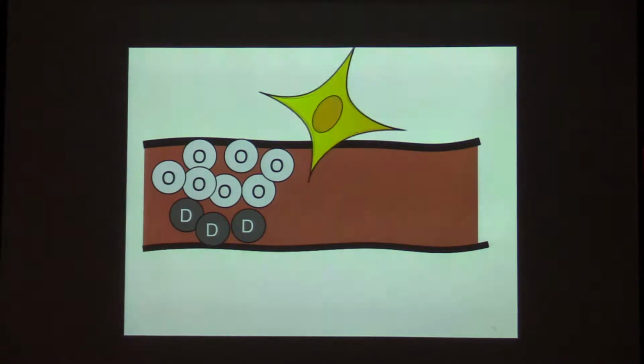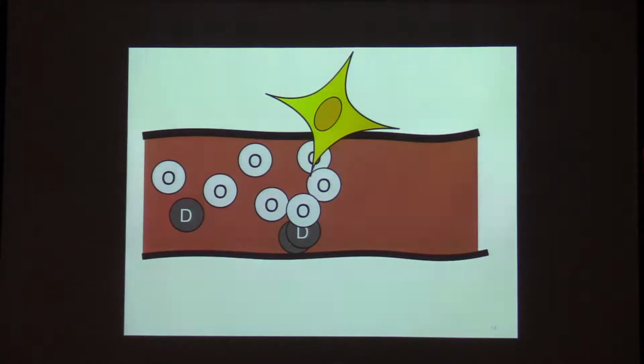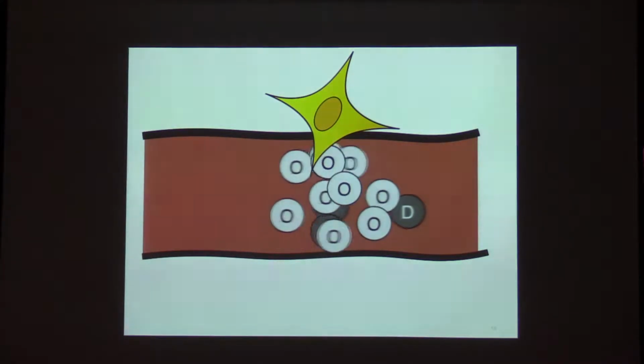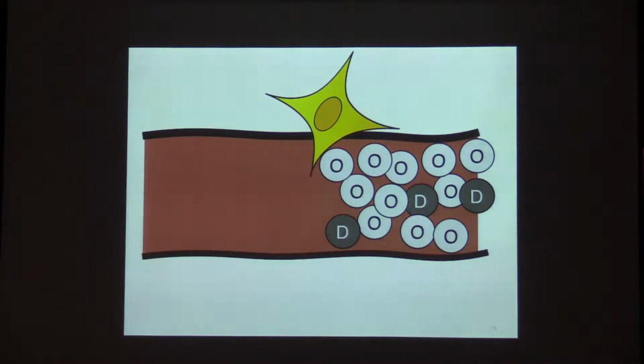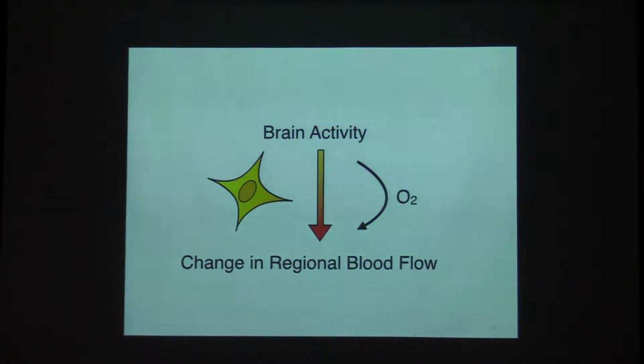So in essence, when your neuron is active, you've got your oxyhemoglobin, and some vasoreactive things going on. Now you get a lot more influx of oxyhemoglobin, and therefore your signal actually increases on the fMRI, okay? There's a baseline amount of deoxyhemoglobin and susceptibility, but when your brain is active, a lot more oxygen comes in, and oxygen here is bright. So another way of looking at this is that brain activity, instead of causing oxygen depletion so that you want more blood, actually does the opposite. Brain activity causes blood flow to increase, and that's why you have more oxygen in your local microvascular environment.